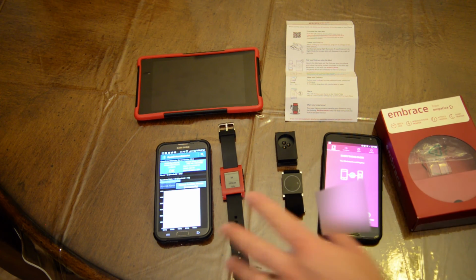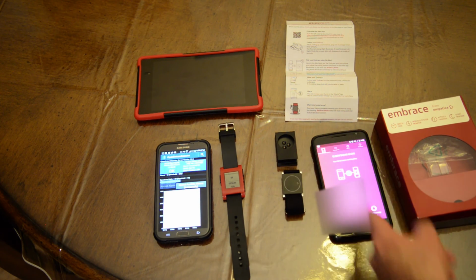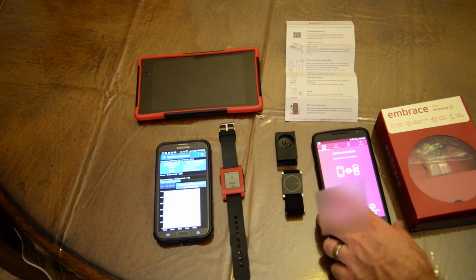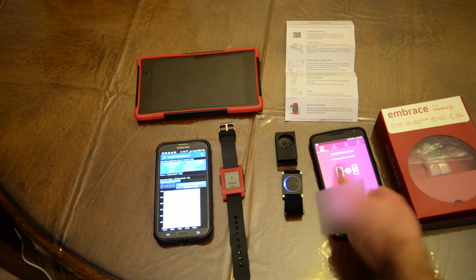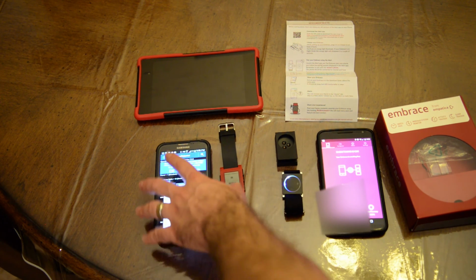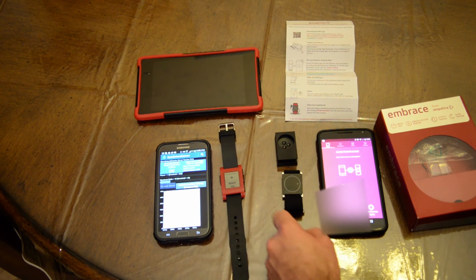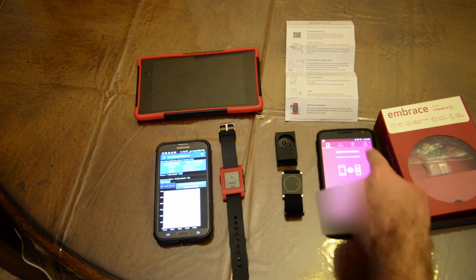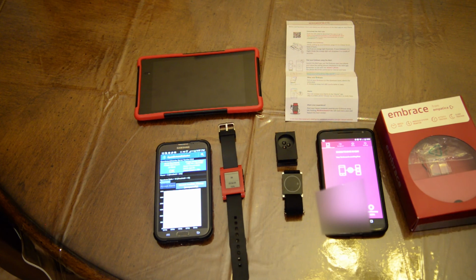It does have its pros and cons. We have no idea if the device is working. If this device turns off, there's just a red X. It doesn't really tell us anything. With the other one, when it disconnects from the phone, it will go crazy. It will start beeping and beeping to reconnect. This one doesn't do that. It just shows us a red X.